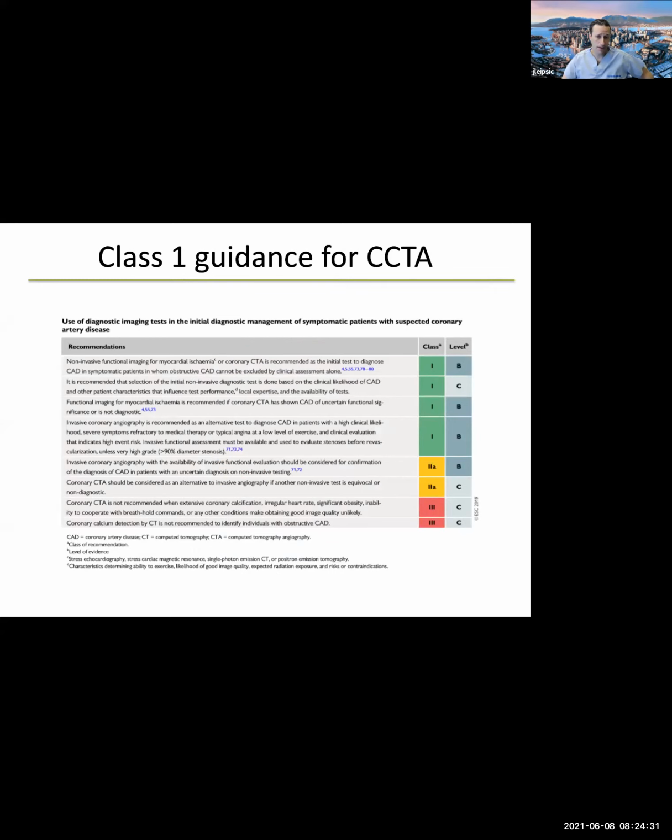So I think for all of these reasons that CT is highly accurate anatomically, it uniquely identifies plaque, it's powerfully prognostic, and allows for the personalized titration of medical therapy in a fashion that reduces incident MI, that the Europeans 2 years ago came out with a class 1 guidance, and in fact suggested that CT should be the first-line test for the majority of patients without known disease, except for those at a very high pretest likelihood.